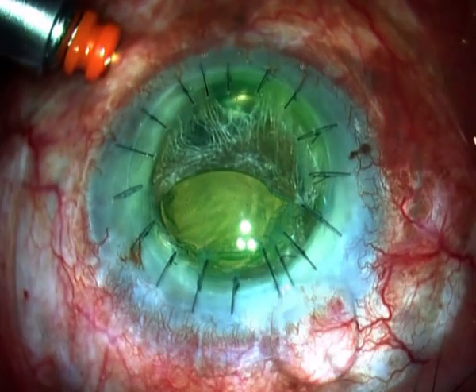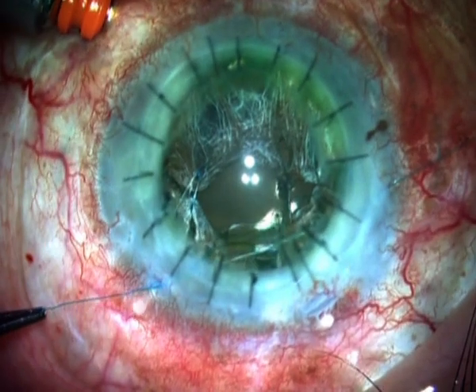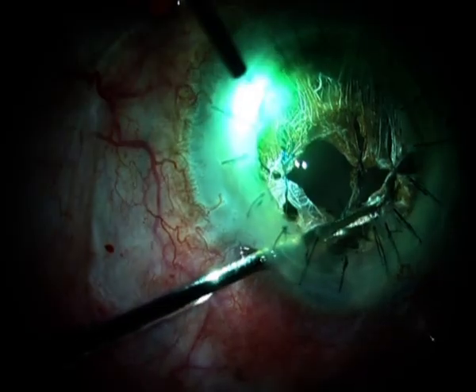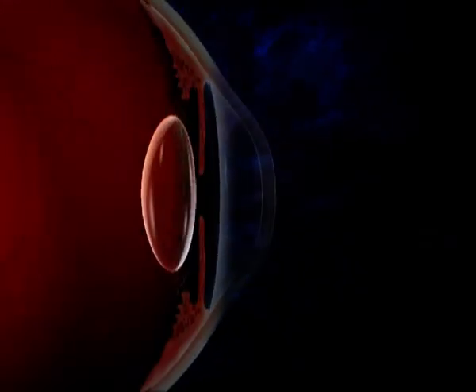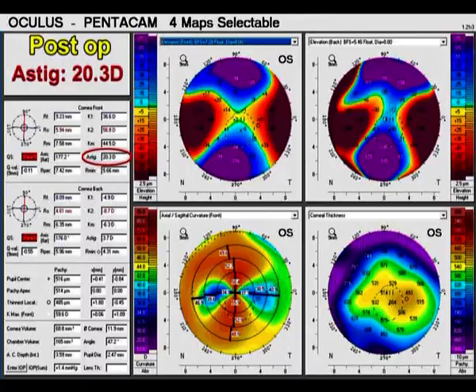Approximately 15 to 31% of patients undergoing full-thickness corneal transplantation may develop post-operative astigmatism greater than 5 diopters. Astigmatism after corneal transplantation can cause visual loss despite a clear corneal graft. Pinhole pupilloplasty, PPP, helps achieve the pinhole effect. A patient with high astigmatism after penetrating keratoplasty improved to 6/12 after pinhole pupilloplasty.